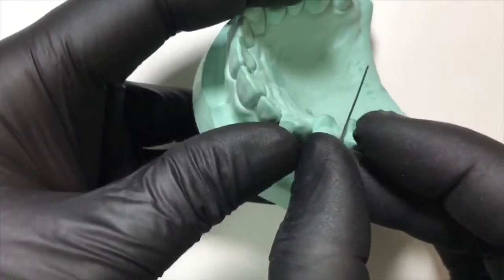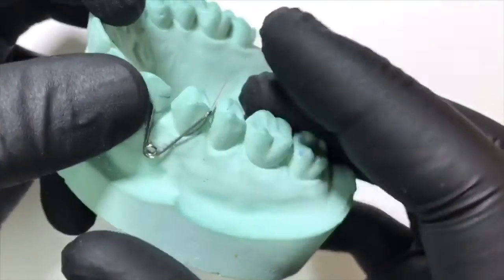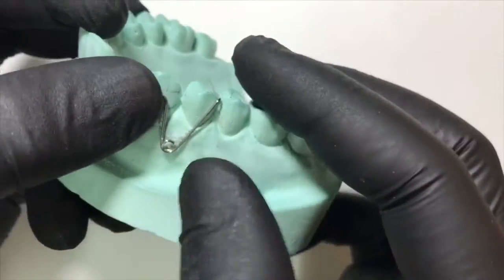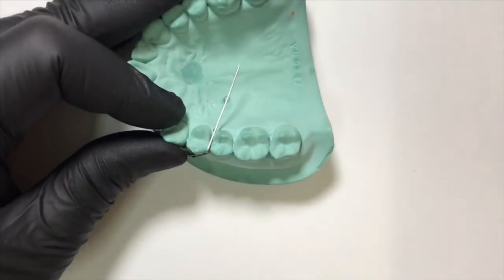We check the adaptation on the palatal aspect — it is now perfectly adapted and well into the embrasure. We can begin with the palatal adaptation on the retentive arm.